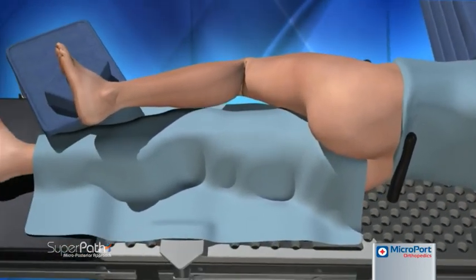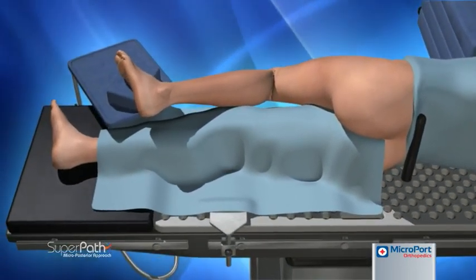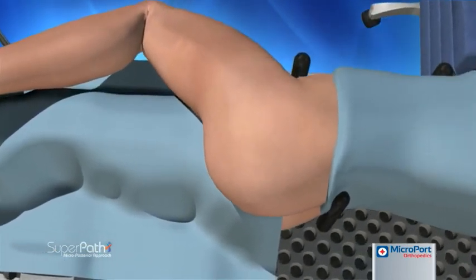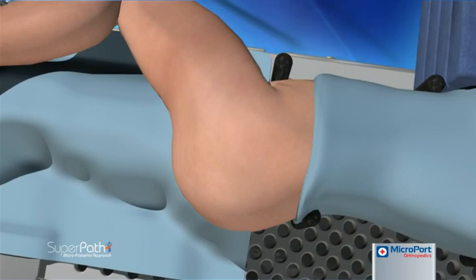Resting the operative foot on a padded Mayo stand with the leg in slight adduction, the weight of the operative leg will bring the pelvis to the balanced neutral rotation. This is the home position of the technique, as the operative leg will remain there for most of the procedure.